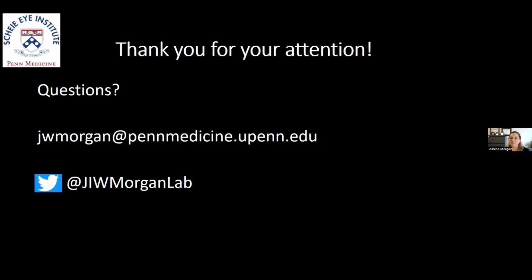I see what you're asking. Okay, so there certainly are studies that show the initial starting point of the cone reflectance changes over minutes, hours, days, and depends on pupil position. We certainly know that. What is nice about the method we're using currently is that we have this standardized approach, where we're really looking at a change in reflectance. And so our measure is essentially irrespective of the starting value. I see. Okay, thank you.